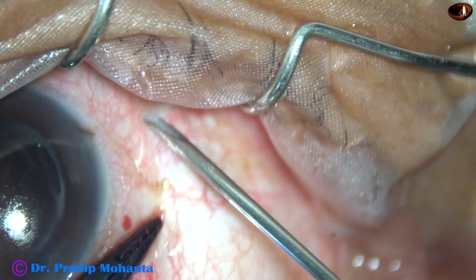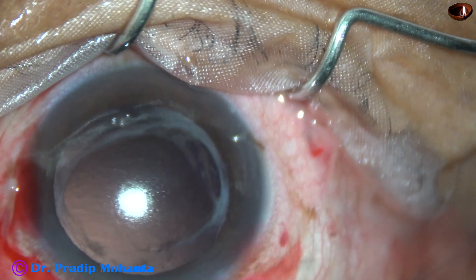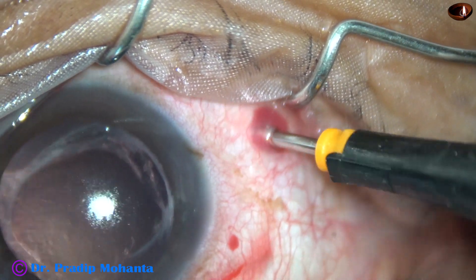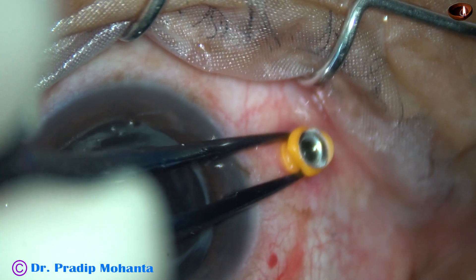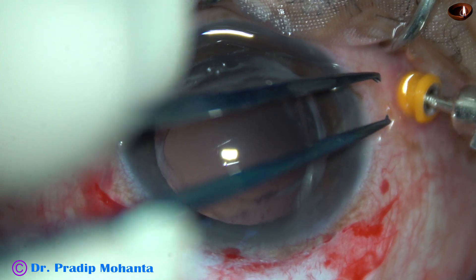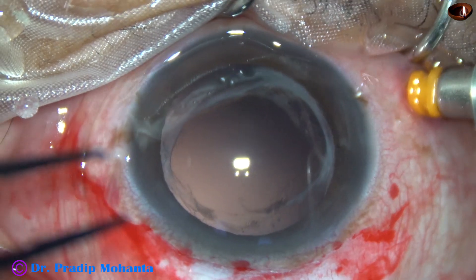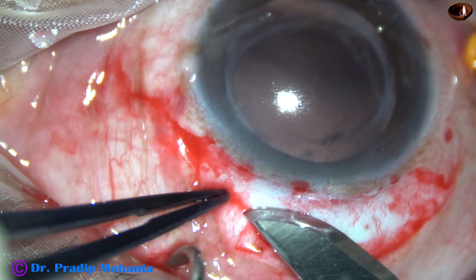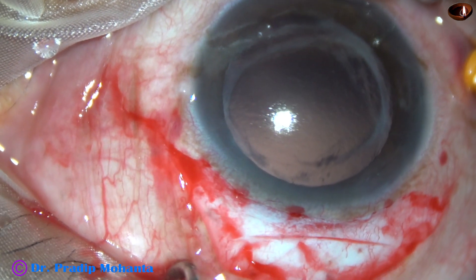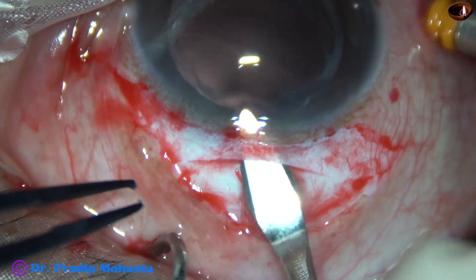Now a trocar is being placed in the infero-temporal quadrant. This is a 23G trocar, and then irrigation is attached to this trocar. Now a sclerocorneal tunnel is being fashioned. The width of this tunnel is about 6 mm.